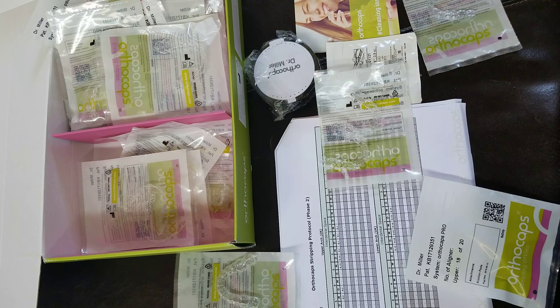This is not like a regular aligner system — they have some different things you can't get with anyone else. First, they send aligners in batches and you can choose the quantity: I think it's 8, 10, or 12. The benefit is you can stop and not have to throw away all those aligners. They generate a heat map — after the initial movement of the first set, you do another scan or impression, send it in, and they do a heat map to see if you're tracking. If you're not tracking, they'll tell you to go back. So you have to tell your patient to keep all their aligners, otherwise they regenerate the next set.